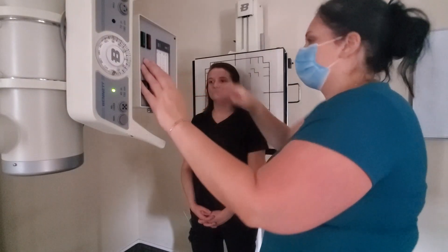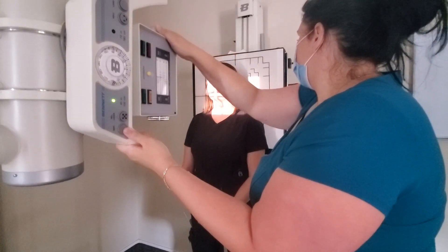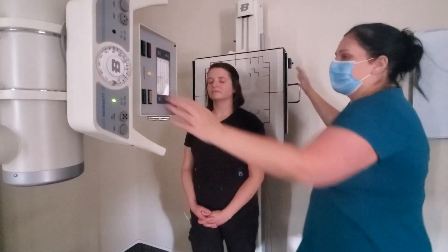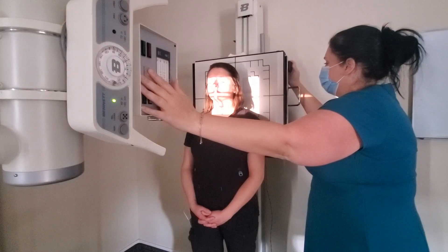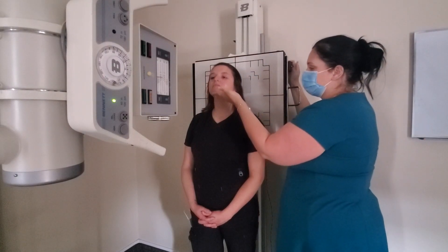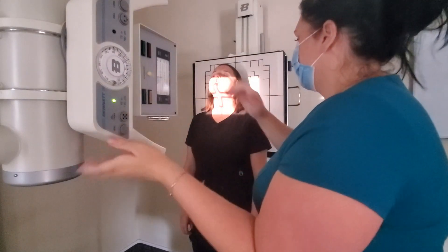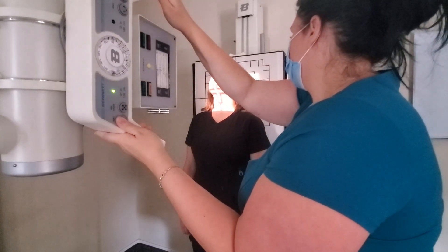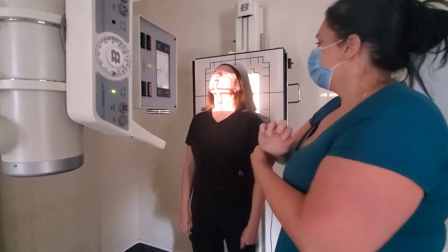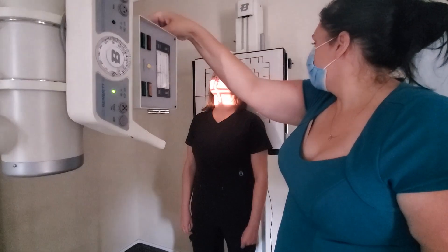I'm just going to have you close your eyes real quick and open my light field. For your first image with the Fuchs method, you're going to have your patient extend the chin upwards. The centering is going to be just distal to the tip of the chin. Touch the tube, touch the bucky — true AP — just distal to the chin.